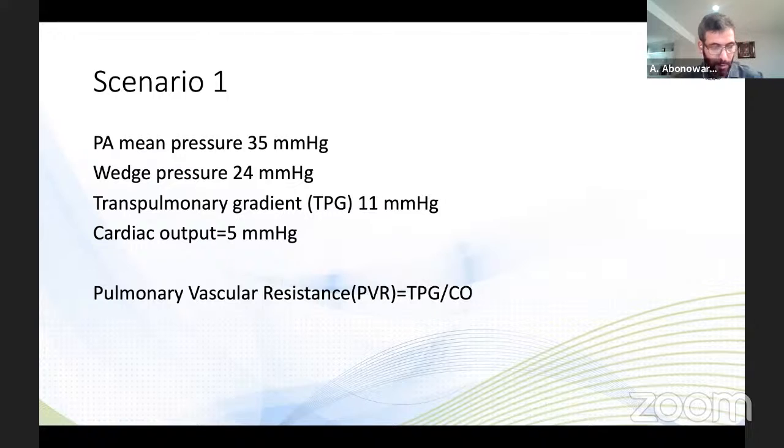There's a question about pulmonary artery catheterization for pulmonary hypertension and responsiveness to therapy. Dr. Sam Haley, do you have any comments about that? If you give patients treatment for primary pulmonary hypertension, especially, for example, calcium channel blockers, responsiveness to that, and the role of a right heart cath.